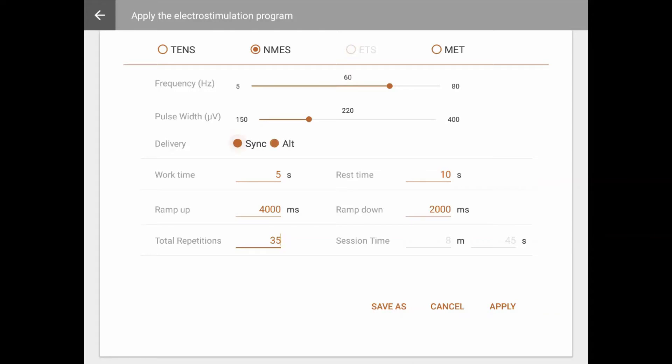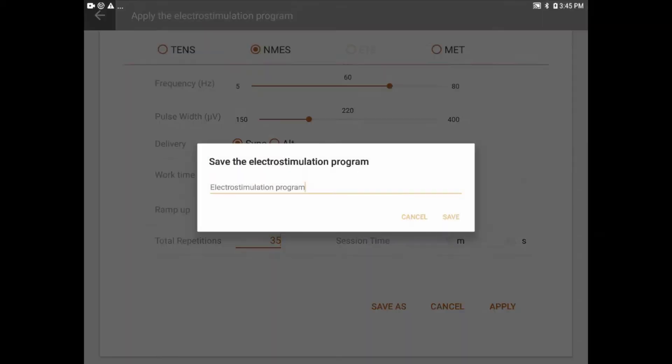After adjusting all settings, before starting a session, you will be prompted to adjust amplitude for each channel. For safety reasons, this is done on the Mionics device itself. After adjusting settings, you may click Apply to use the settings for this session, or Save As to save the program under a new name for future use.